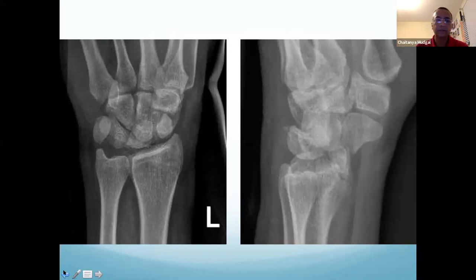How would you expect a candidate to be explaining or describing the X-ray? The first thing I'd say is I expect them to spot it. And I think if you've spotted the fact that this is a perilunate, half of the battle is won. Looking at this image, it looks as though the scaphoid is fractured. There may well be a fracture to the lunate as well. But if they've picked up the fact that this is a perilunate injury, it's a high energy injury, they need to exclude other concomitant injuries and assess the patient from an ATLS perspective. Your battle is already partly won.